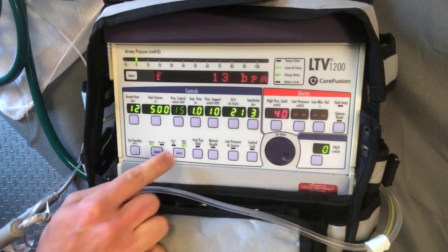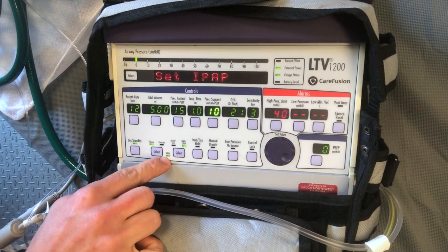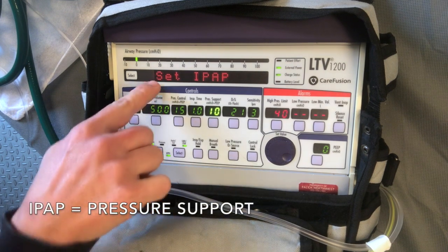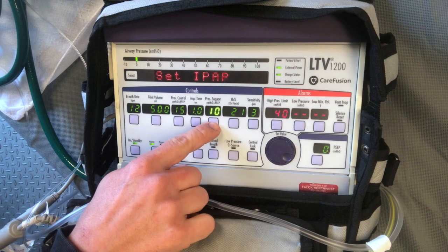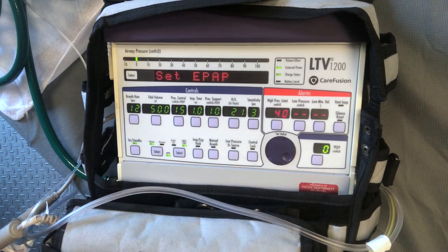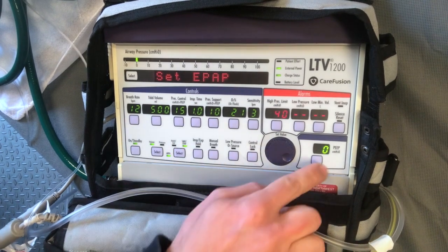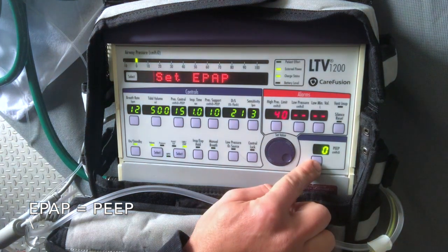Now press the Mode Select button until NPPV is flashing. Now you can note that the Set IPAP is illuminated in your interface and pressure support is illuminated. Confirm, and now note that Set EPAP is on the interface and your PEEP is illuminated.